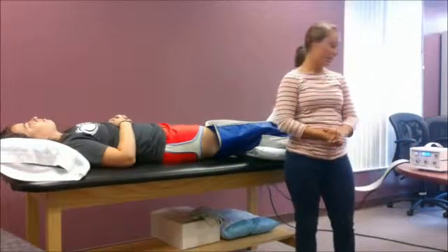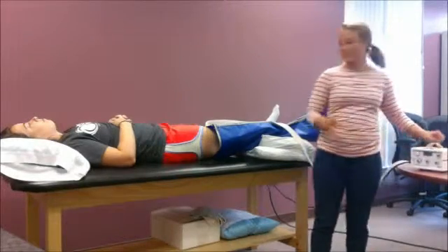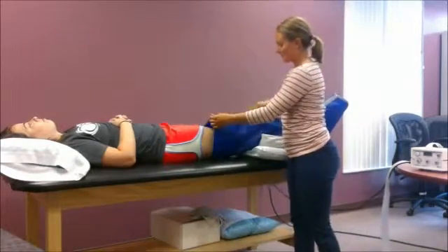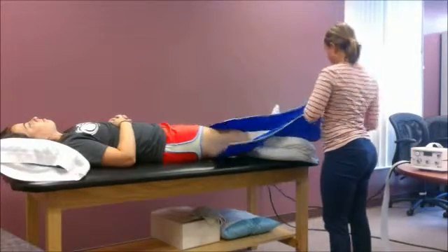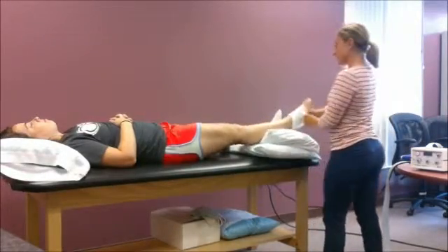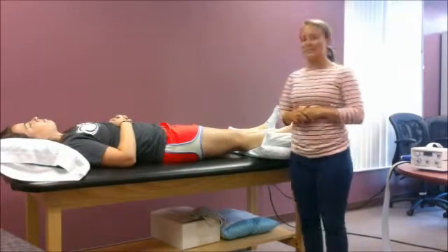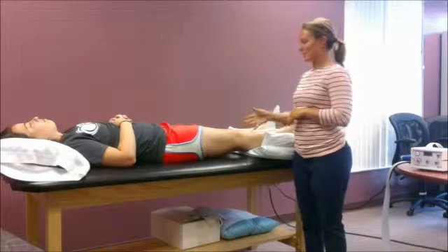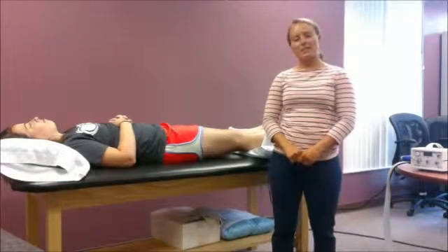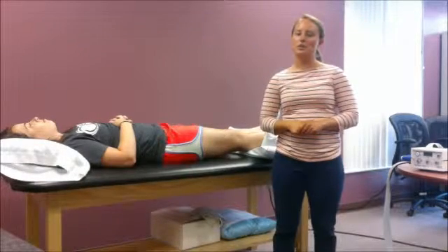After 2 hours, I would come back and turn the machine off. I would remove the compression sleeve and remove the stocking. I would assess her skin and also assess the patient to make sure she's doing okay. The outcome for this treatment is to facilitate healing of the ulcer a little bit quicker than it would had compression not been applied.